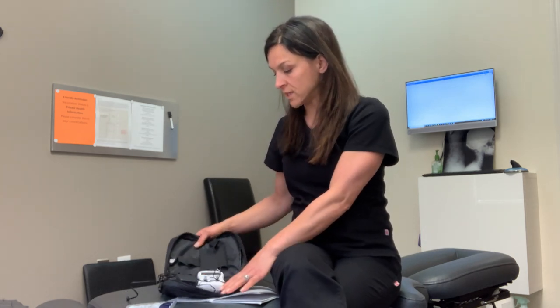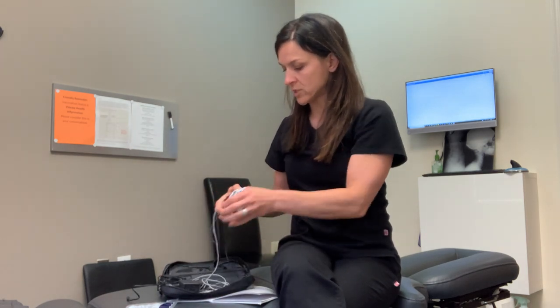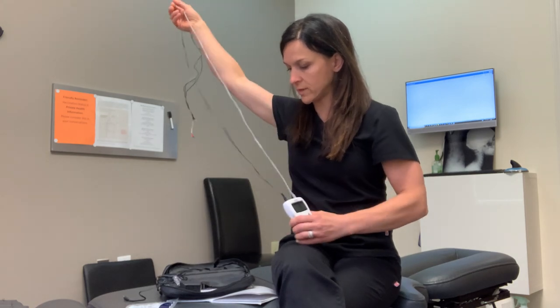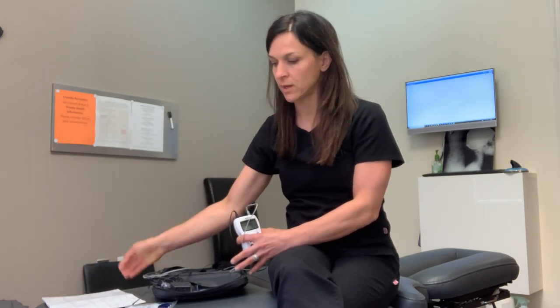When you receive the unit and unzip the bag, you're going to find the actual device itself, and the electrode leads will come with these long wires. There's also a book that is very helpful and handy, and we'll talk about that in a minute. And then you have your electrode pads.